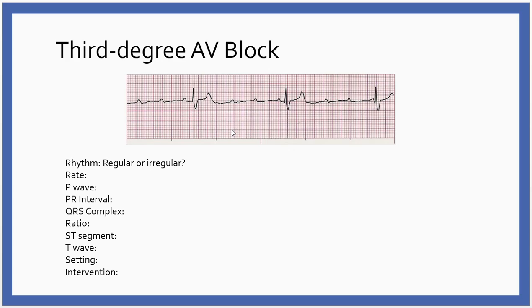What do you suppose cardiac output is like? I mean, I got plenty of diastolic filling time, but you'll notice the atria are contracting away, sometimes even when the ventricle is trying to repolarize and things like that. So my cardiac output isn't likely to be very good.